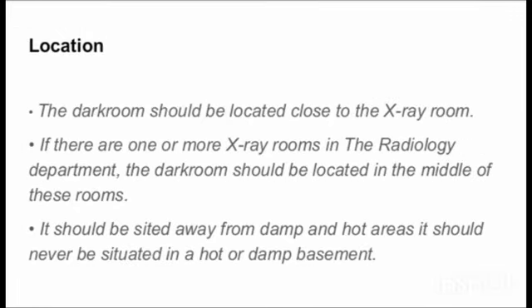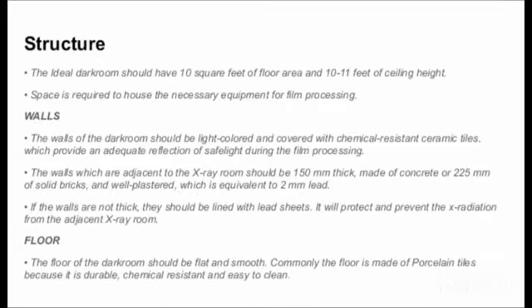Location. The darkroom should be located close to the X-ray room. If there is more than one X-ray room, the darkroom will be located in between both the rooms. Actually, it should be located away from the hot areas or from the basement department, as it may cause changes in the chemical concentration.